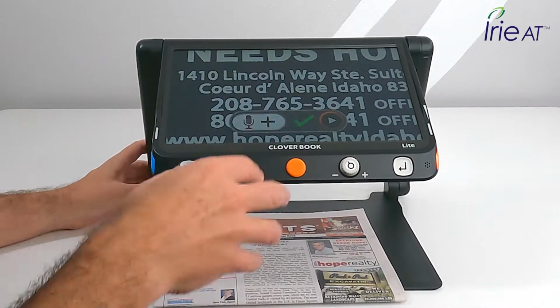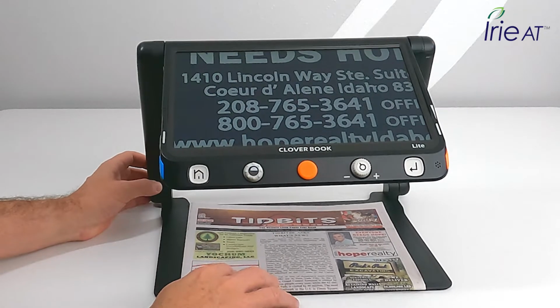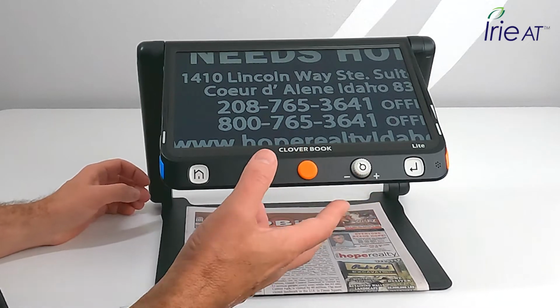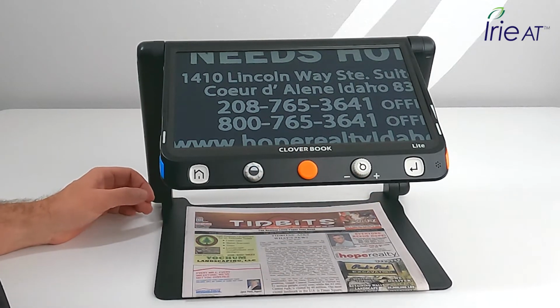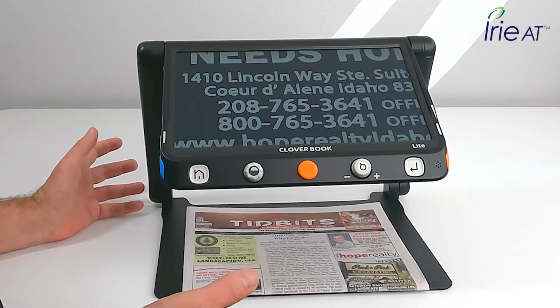It's really handy to be able to look at those photographs and have them actually visually identified that way. So pretty cool feature to be able to save the images, but then also be able to put voice memos on them. So if you can't read all the stuff, which isn't all that rare in low vision, you can just hear it.